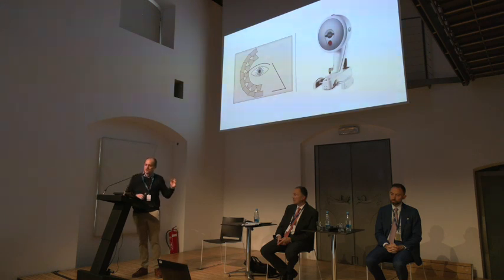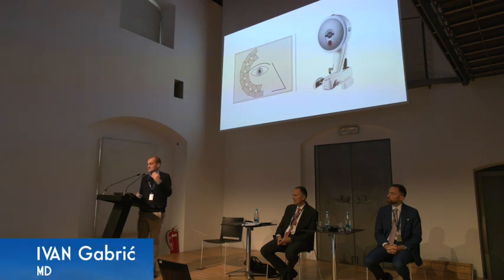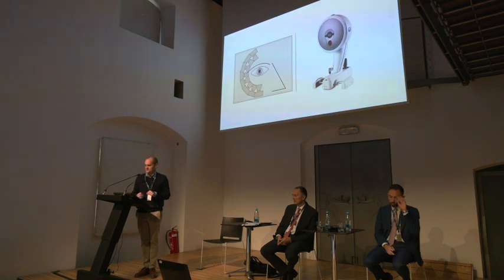The problem is the Oculus software is so good that it makes a model that fits the data and you trust it. Now, if you in your head divide 180 by 25, which is the eye, and divide it into 25 slices, it comes out to 7. So the Pentacam makes one scan every 7 degrees. What happens between 0 and 7 and between 7 and 14? Software happens. The problem is you don't think about it in your daily life. You just trust it. You trust it because the model it uses is good enough. It's not great, but it's good enough. So a lot of things go unnoticed between 0 and 7.